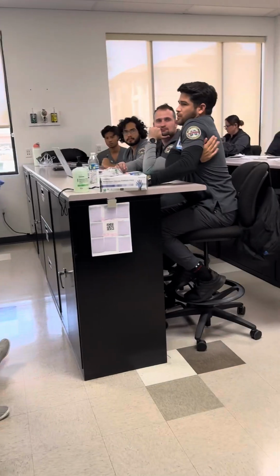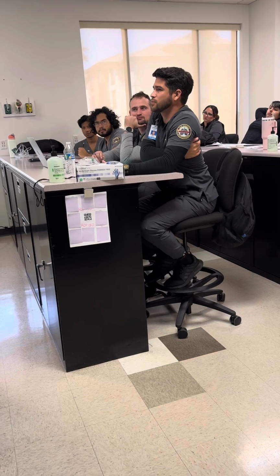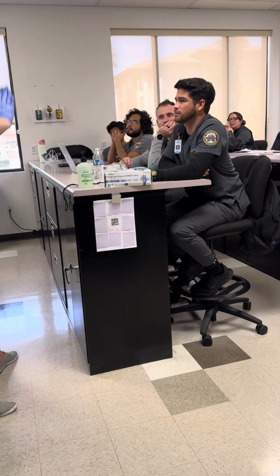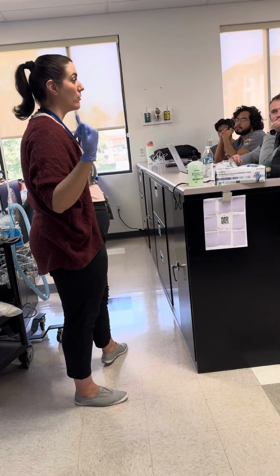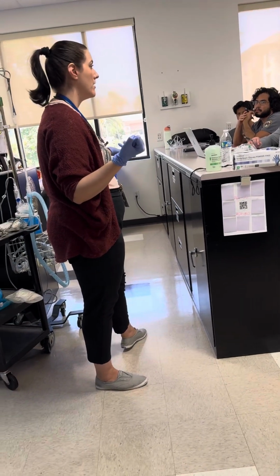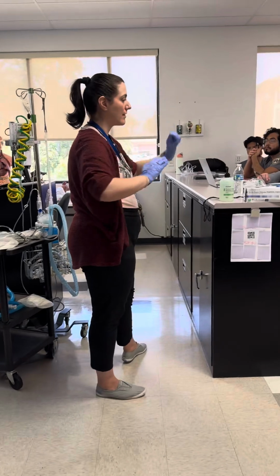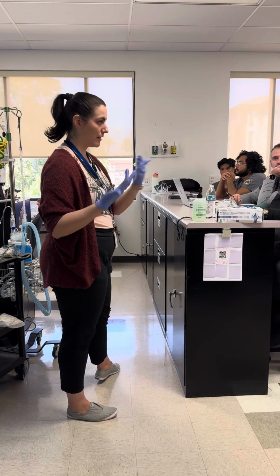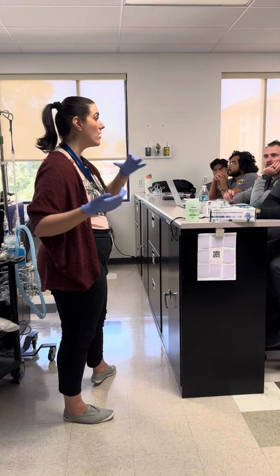Are we looking for a certain bone right here, just for the auscultation? I'm looking for kind of a swooping motion to avoid it, but if you can tell me that you heard it, then I'm going to trust that you heard it. But it's more about practice trying to find the spot that you can hear. Just be honest with yourself. If you feel like you're not hearing it, let me guide you. Let me see if maybe we press it here, or just practice with each other.